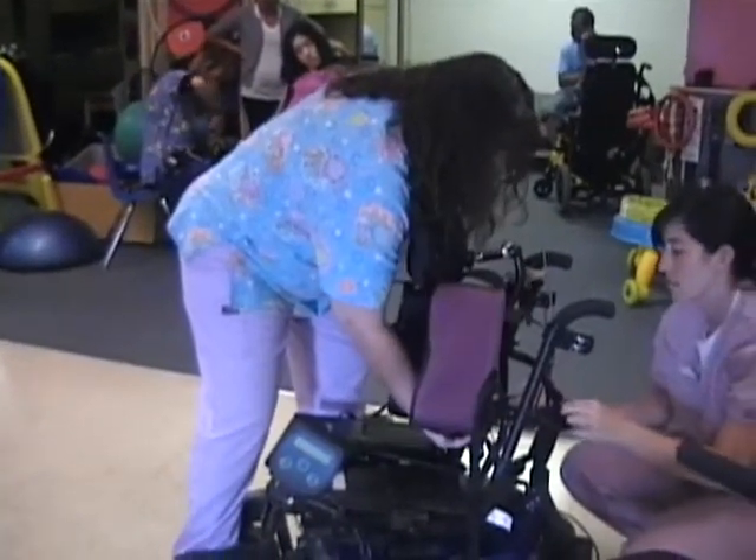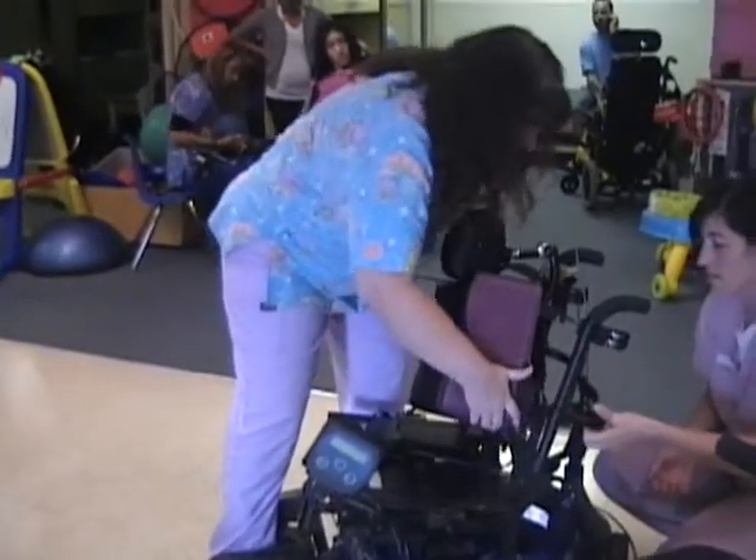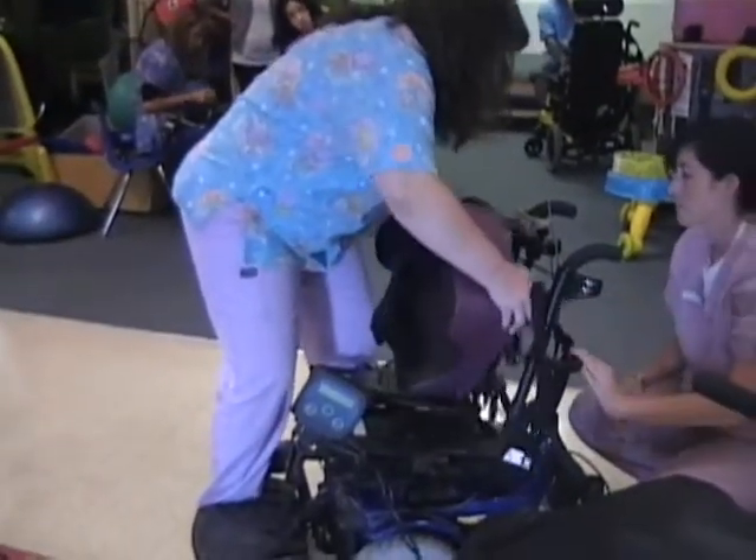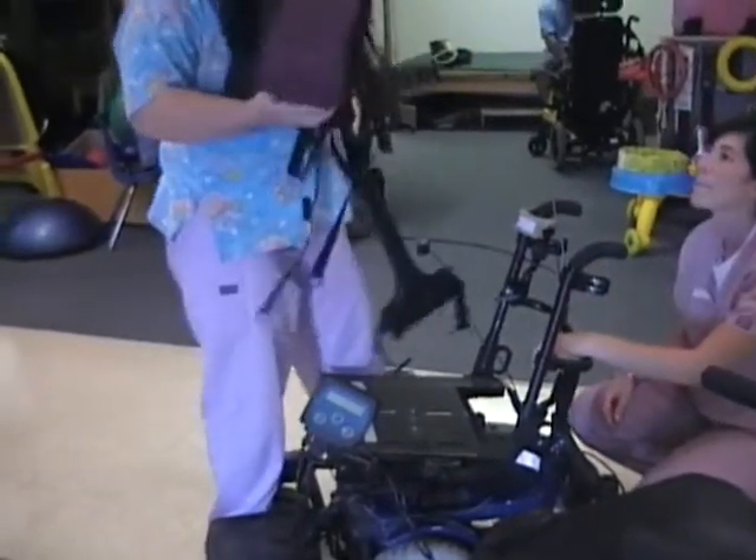This is Lori, Ariana's PT — Ariana's physical therapist — and she's putting the power chair together, which you can see is a little bit of work.